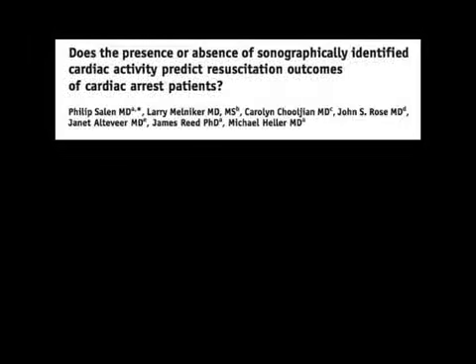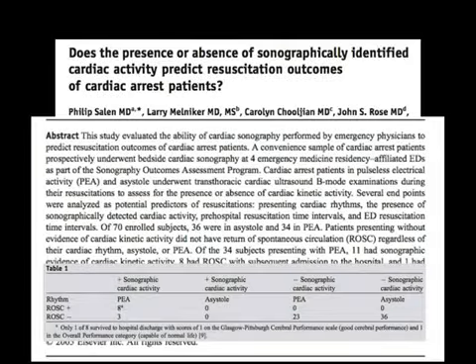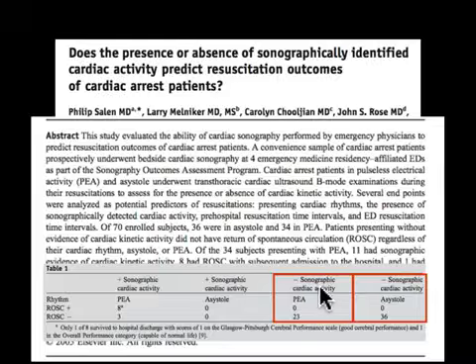And then another study was done by Phil Salin et al., colleagues of mine, John Rose and those guys, who did a similar study, basically the same exact concept, but they looked at if you had no return of sonographic cardiac activity, no matter what your rhythm was, you did not have ROSC. You did not have return of spontaneous circulation in any patient. Not a single one. Again, small numbers, small studies.